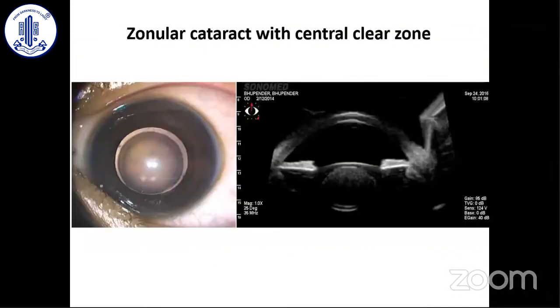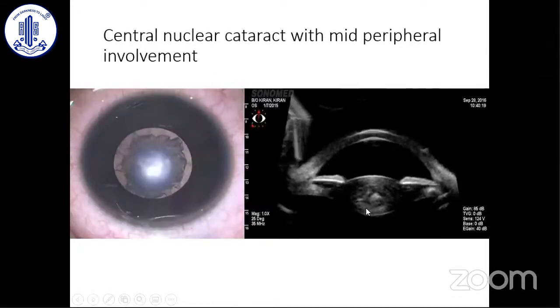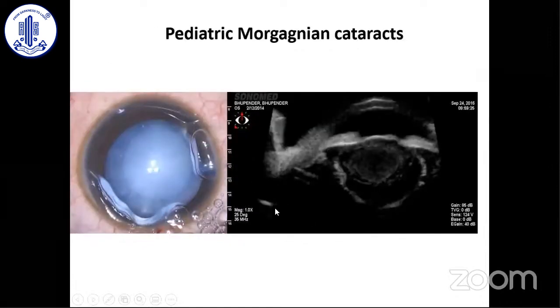I'll show some UBM findings. This is a typical zonular cataract — the central part is clear, picked up on UBM as well. This one has central calcification, easily identified on UBM. This one doesn't look like a zonular cataract but on UBM the entire volume of the lens is intact — so this is not an absorbed cataract yet. Whereas this patient has a Morgagnian cataract, actually floating in the front, with the entire nucleus floating around.